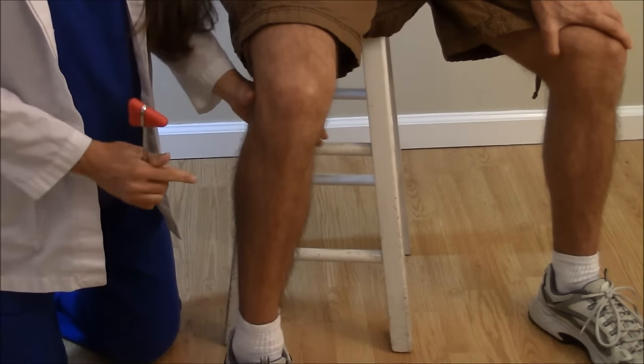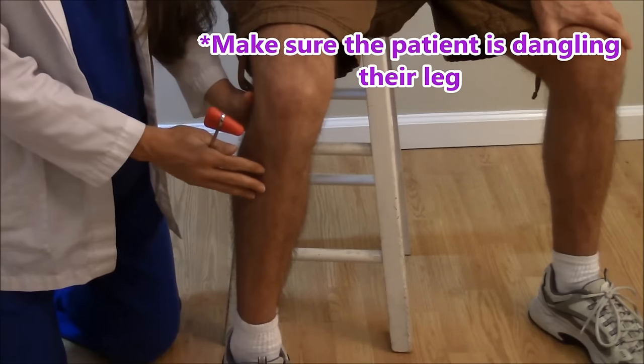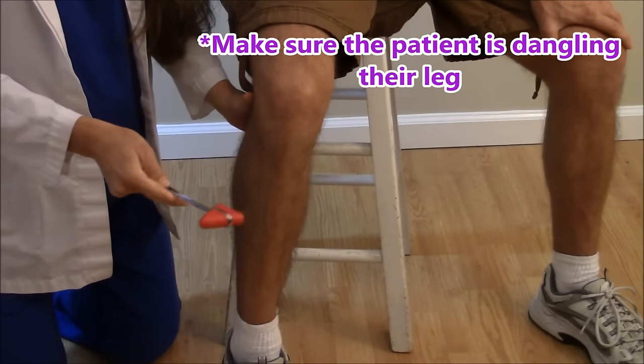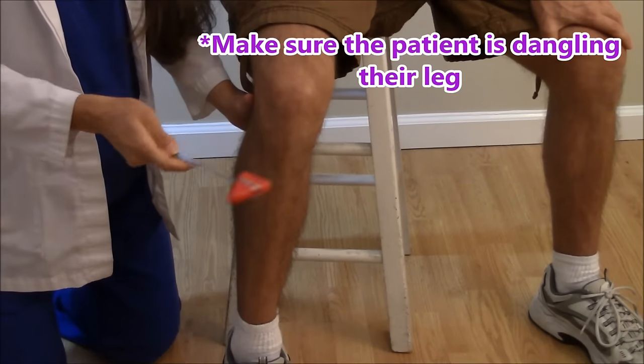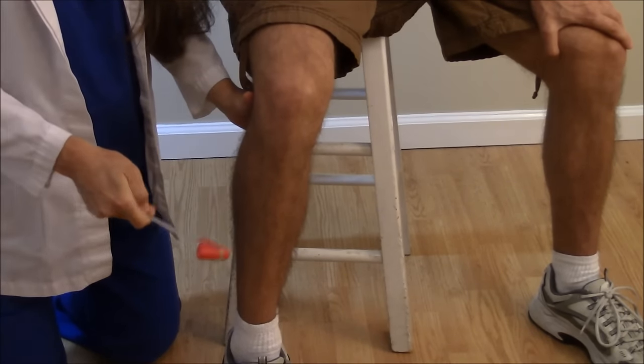After locating the tendon, put your hand behind the knee just to support it. Have them relax — the tendon is right here. What you're going to do is tap briskly, and what we're looking for is this lower leg to extend outward. So here we go.